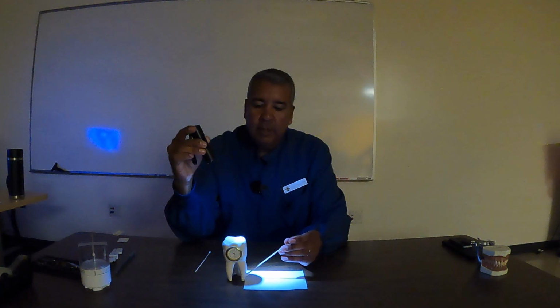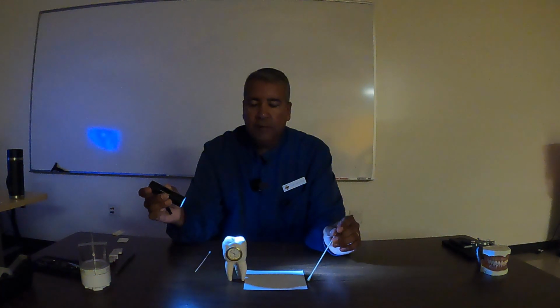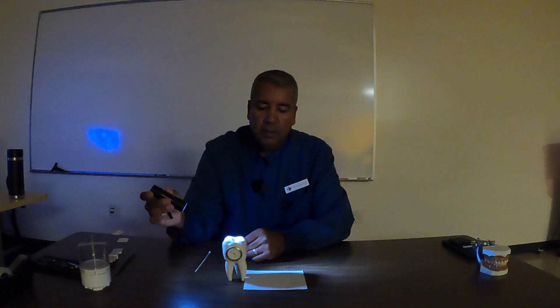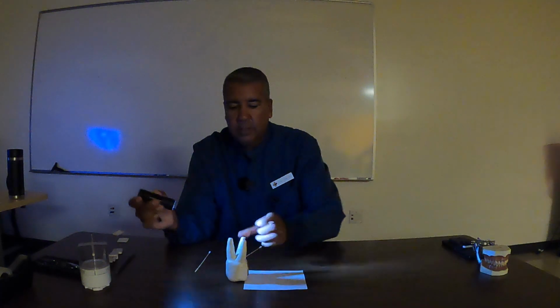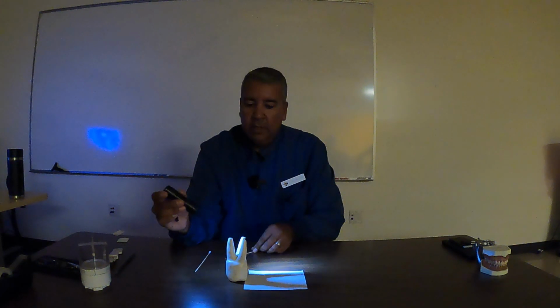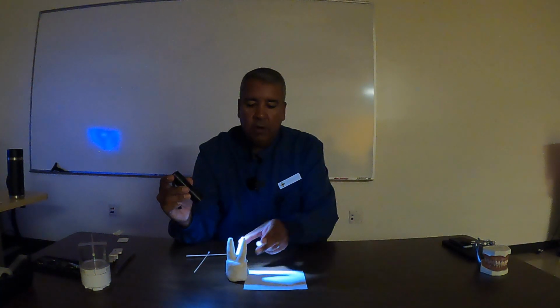So what do you think if I now take this PID and I position it to where it is less than the bisector? What do you think is going to happen to this image? It'll be elongated. So if I take this and I bring it down, you can see that it now stretches and it goes off of the film. It is elongated. And actually that would even be upside down like this. And those apices that were on there are now off. And what we're trying to make sure is that the apex is on.